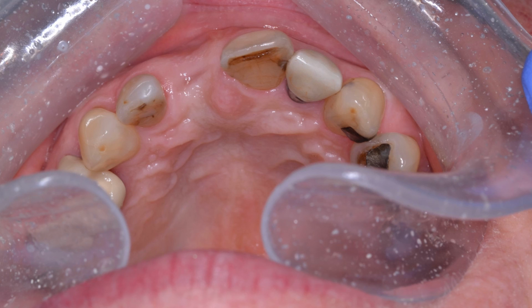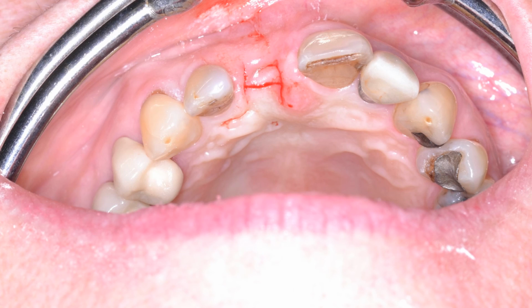You can see that there is a slight inflection on the buccal aspect there. So we have had a little bit of buccal hard or soft tissue loss. We put an H incision inside there in order to maintain the bulk of our connective tissue. Given the fact that we have had that loss of tissue, we want to basically tuck that tissue inside. And basically you can see here we're exposing the implant.